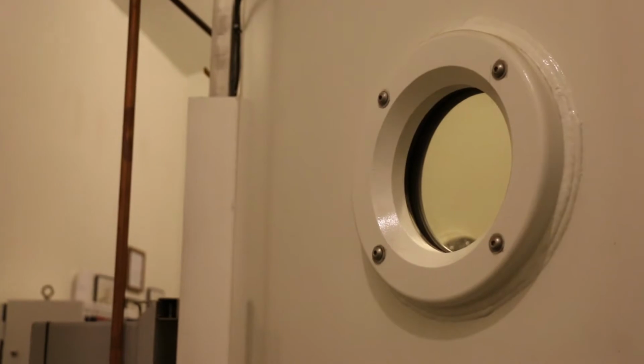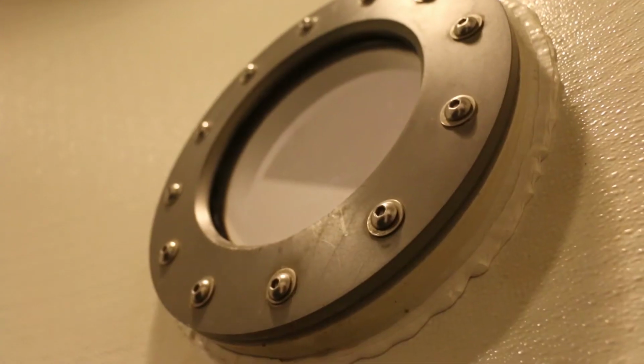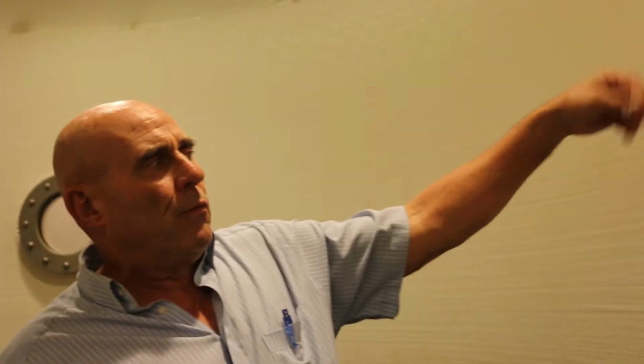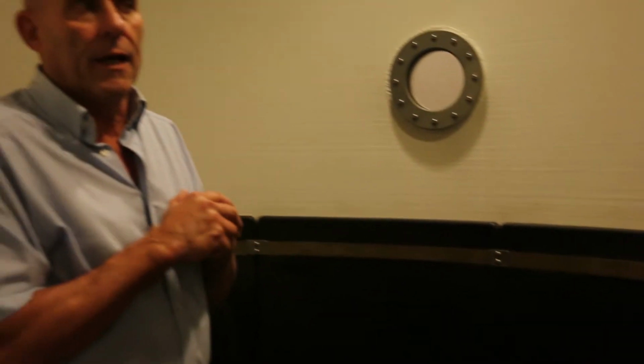Some of the older chambers, they found that the wrong kind of light shining through the acrylic port all the time would cause crazing. That doesn't happen anymore. But we'll take a credit card and scrape the inside of this, and if there are any little teeny nicks in the acrylic, we have to buff those out so we have perfect acrylic surfaces.